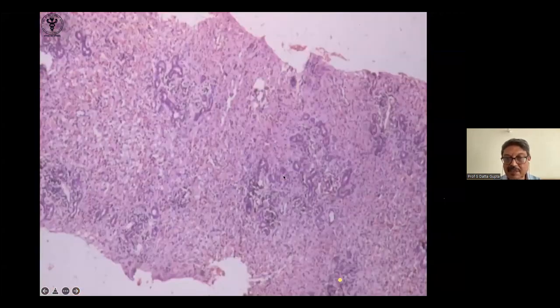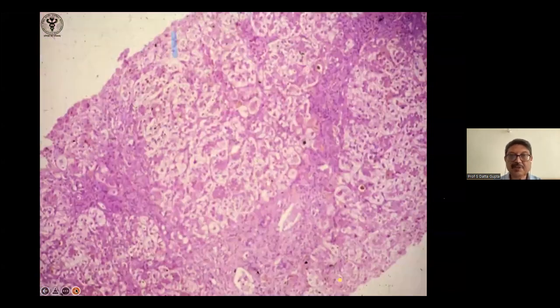This would be bridging necrosis, you see, extensive with panlobular necrosis also. See here, portal to portal, they're so near. Naturally, the liver span will be decreased in this case, and it is almost like fulminant hepatitis. This is a good example of bridging necrosis. That was panlobular bridging necrosis. See, from one area to another. From far, it looks almost like cirrhosis, but it is not.